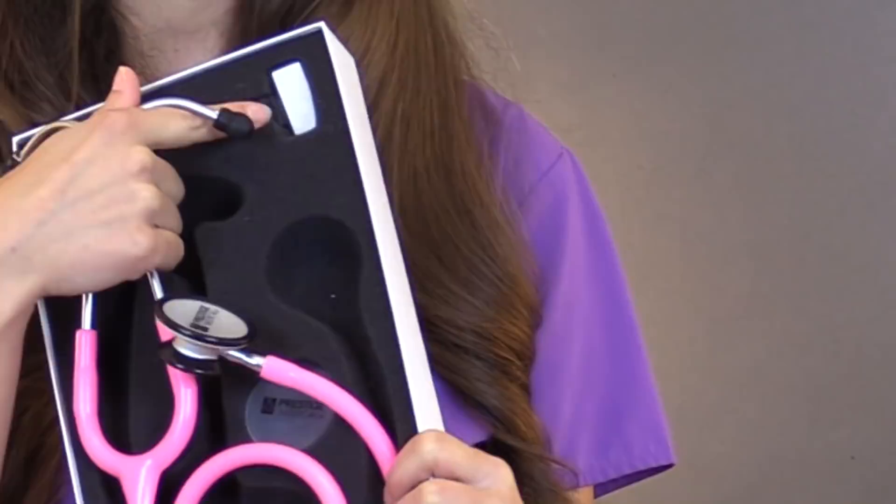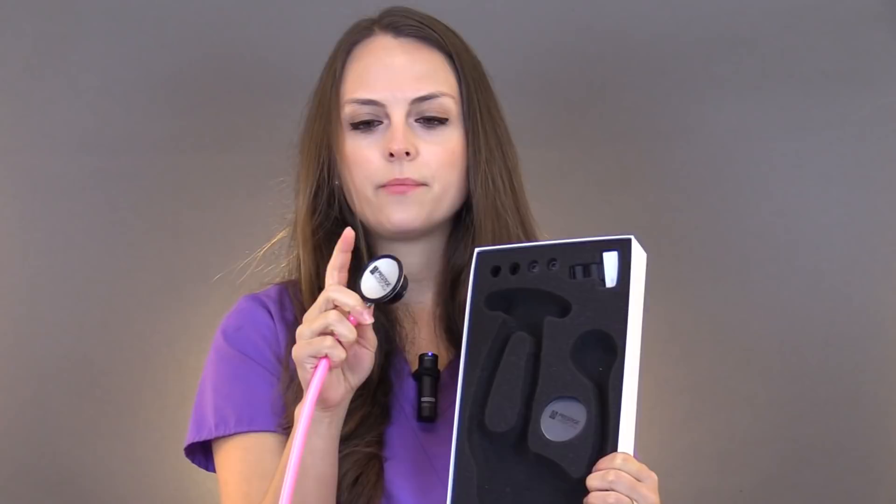It comes with some extra ear tips if you need them, and also a name tag. You want to put your name tag on your stethoscope because for some reason in the hospital stethoscopes go missing, so always tag your stethoscope. Also, the diaphragm and bell is a turnable one — you have to flip it around to listen, it's not tunable. It comes with an extra diaphragm for when yours starts wearing out, and around the bell it has the non-chill ring, which patients really appreciate. And of course, it comes with an instruction manual with great tips on caring for your stethoscope and the warranty.